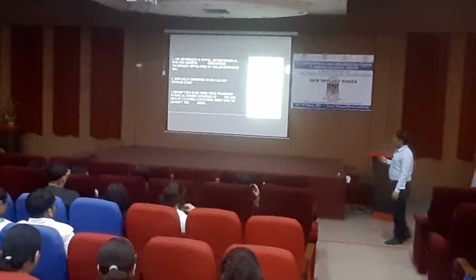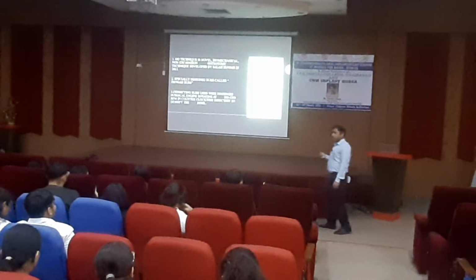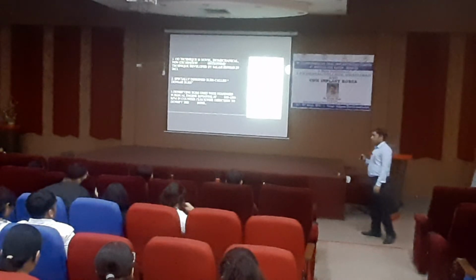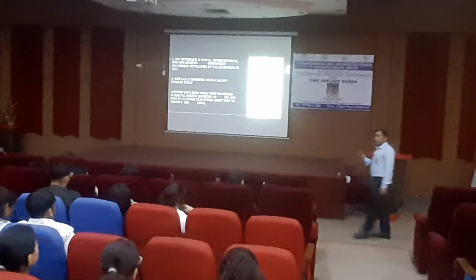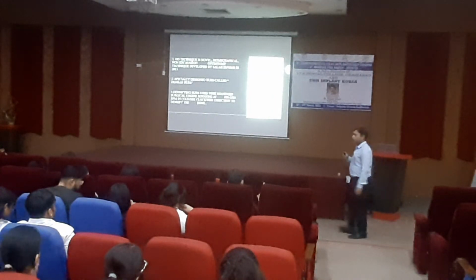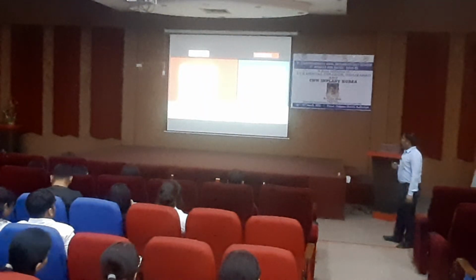These burs are basically used at very minimum RPM, that is around 800. I prefer 700 to 800, and with high torque. Torque should be 40 to 50 Newton. So whenever you use a densah bur, use it at 700 to 800 RPM and torque around 40 to 50 for a good result. Okay, these are the two modes.